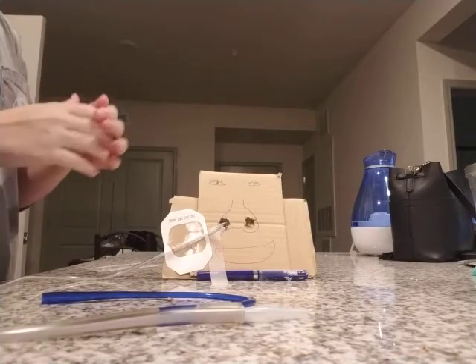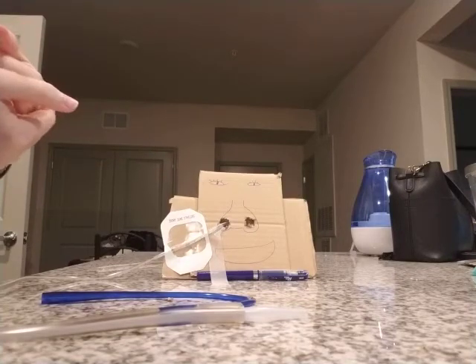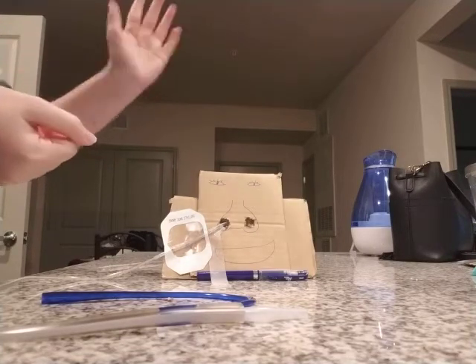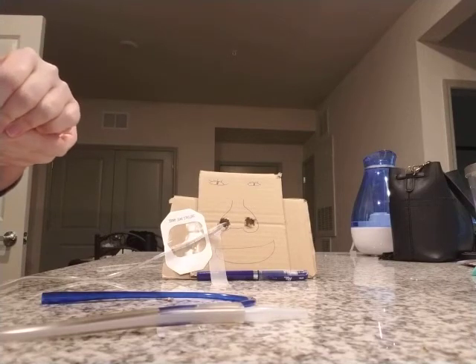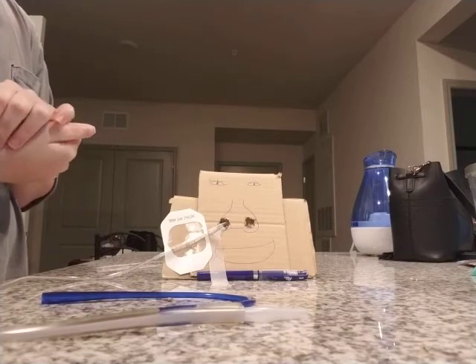And I'm going to place the call light next to the patient's bed. Side rails up times two, bed in the lowest position, except, you know, keep the head of the bed elevated, and ask them if they need anything. Thank you.